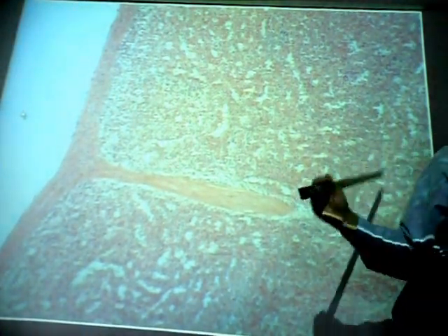What do they call it? Splenic sinus. You can call them splenic sinuses. You can call them venous sinuses. You can call them splenic sinusoids because it's actually a type of very porous capillary, or venous sinusoids. What you may not call them, if you wish to get credit, is medullary sinus. There is no medulla here. Okay? So splenic or venous sinus, but not medullary sinus.